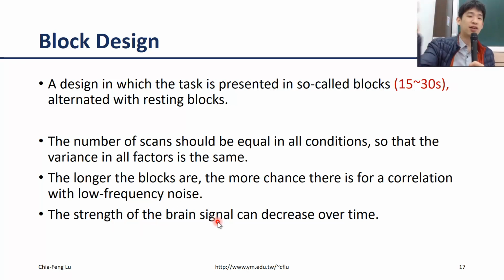If you ask the subject to do hand grasping for a long time, that will saturate the brain or give some fatigue, because you ask the brain to continuously do the same thing. So the BOLD signal will actually decrease over time. You won't see a plateau here. It will decrease over time if the block is too long. So I think 20 seconds is the normal range we use. Don't use too long or too short. Okay.